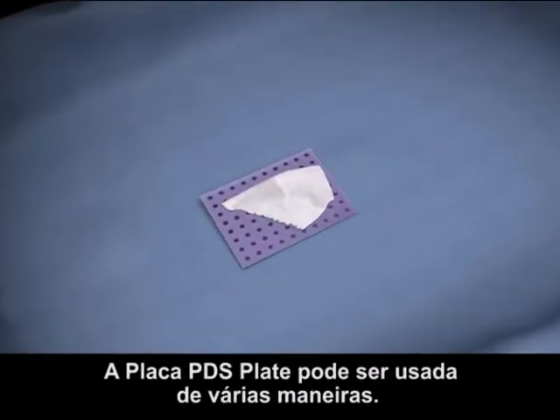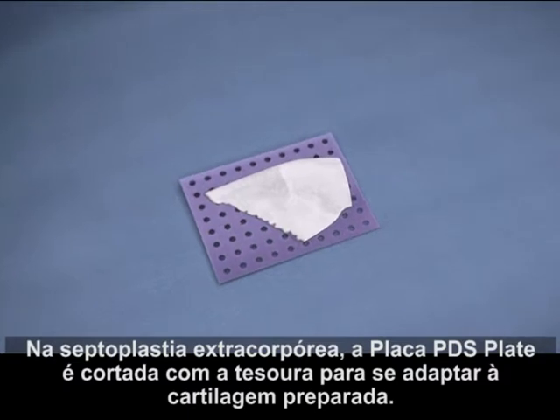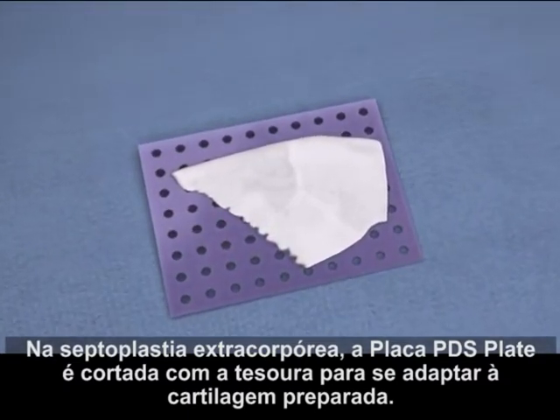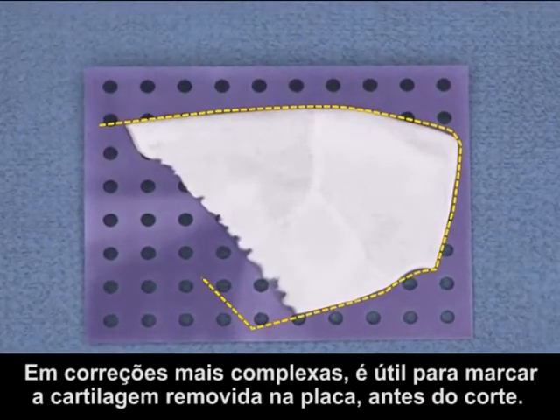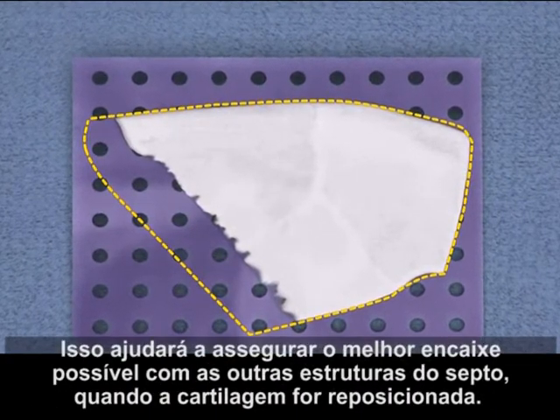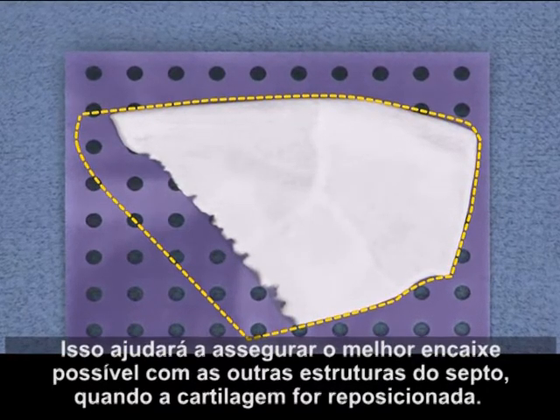PDS Flexible Plate can be used in a variety of ways. In extracorporeal septoplasty, the PDS Flexible Plate is trimmed with scissors to fit the prepared cartilage. In more complex repairs, it is helpful to trace the removed cartilage on the plate before cutting. This will help ensure the best possible fit with other septal structures when the cartilage is repositioned.